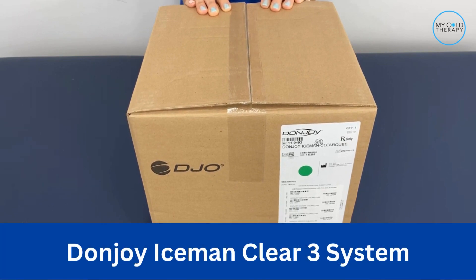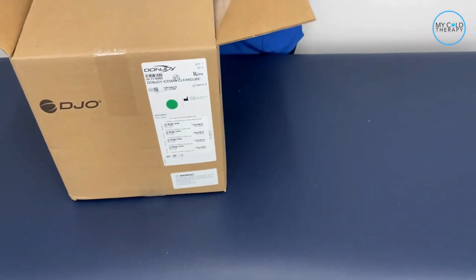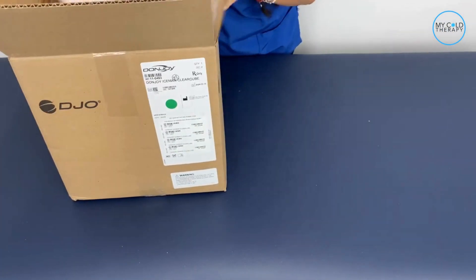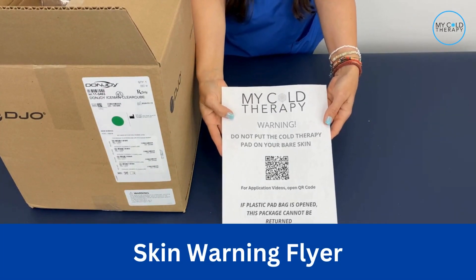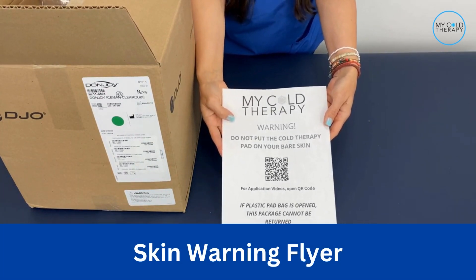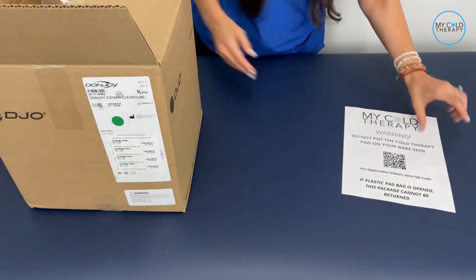For the DonJoy Iceman Clear 3 System. Once you get your box, you're going to open it up. The first thing you're going to pull out is the skin warning. This just serves as a reminder that you can never put the pads directly on your skin and you always want to make sure you have a barrier in place.